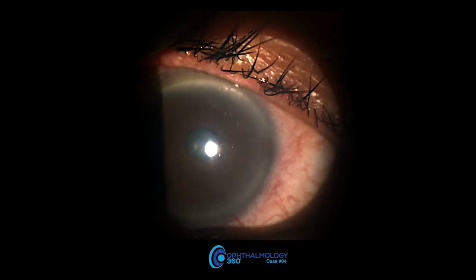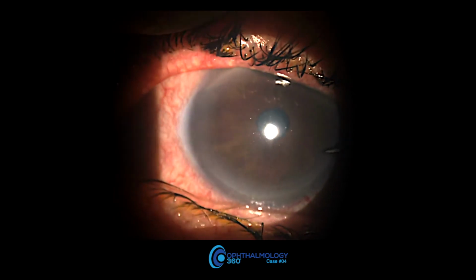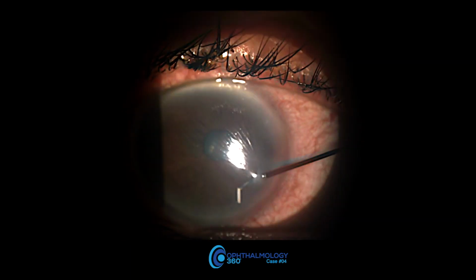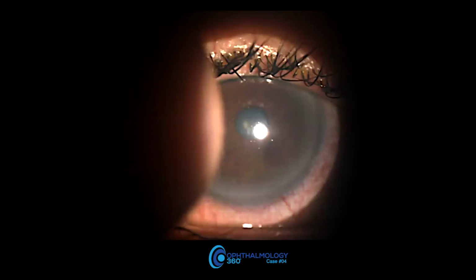So here's a patient, and some of them have a pretty good blink reflex or floppy lid, so it also depends upon who in your office is holding the lid. So be patient. Talk to the patient while you're doing this. Tell them just relax. We're going to hold your upper lid.